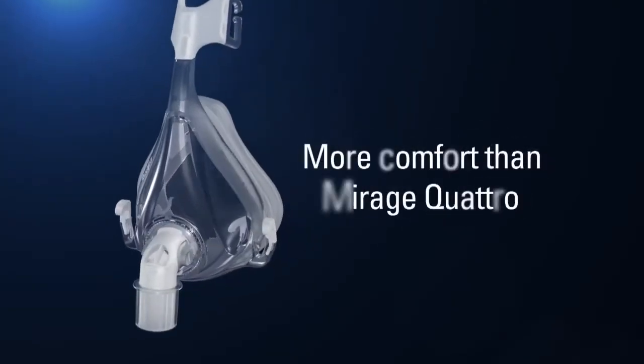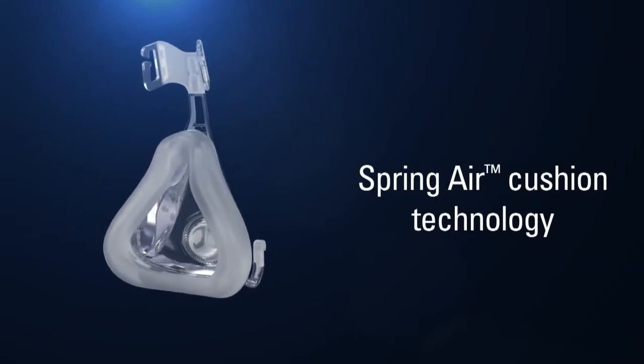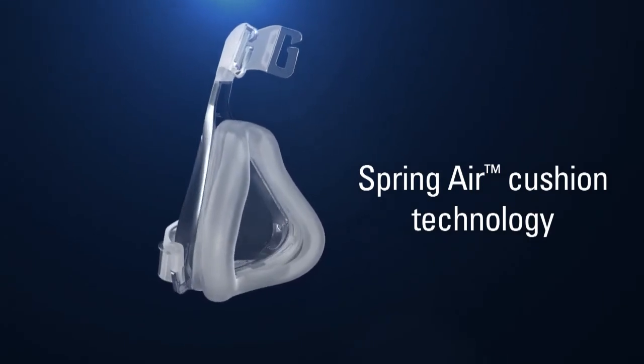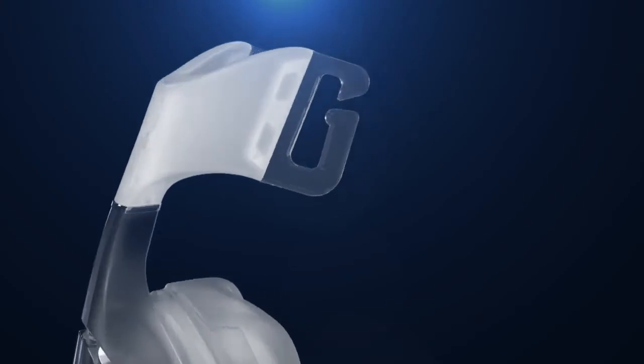Quattro Air delivers even more comfort than the Mirage Quattro mask. The dual wall cushion incorporates spring air technology, reducing pressure on the nose. The mask has an improved cushion design at the nasal bridge and features a new textured surface finish on the cushion, all assisting in patient comfort.